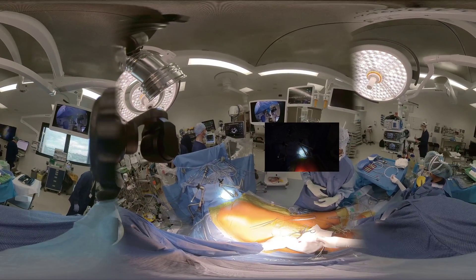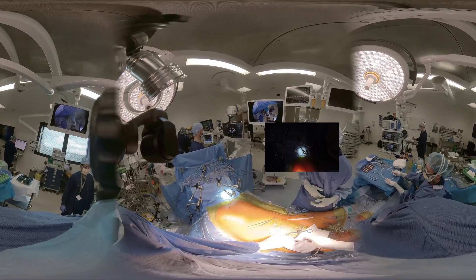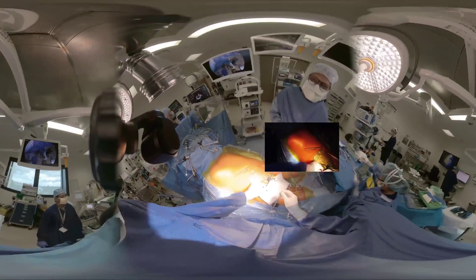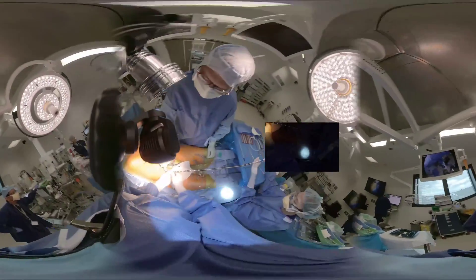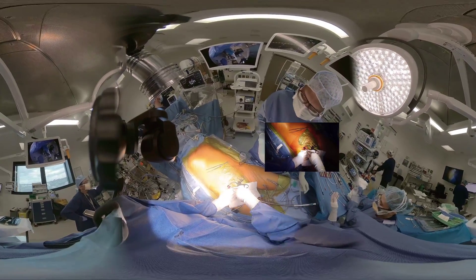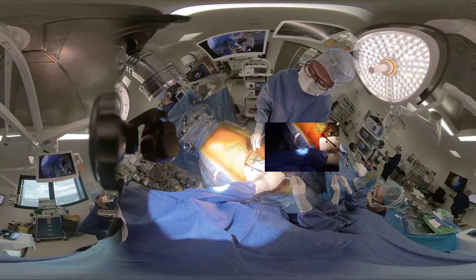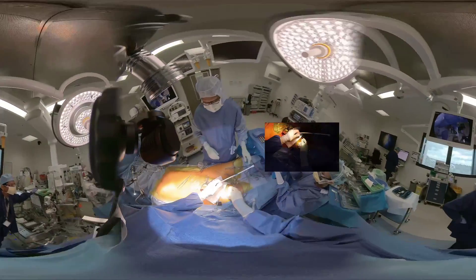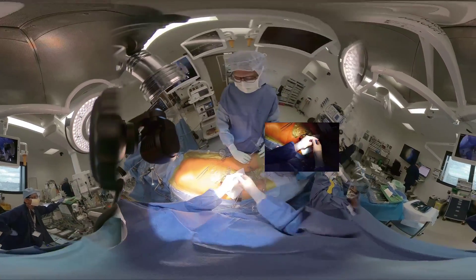Echocardiography is crucial for correct placement and to avoid misadventure with the venous cannula or aortic dissection with the arterial cannula. Good venous drainage is usually obtained with a multi-stage vacuum-assisted femoral venous cannula. We use the Biomedicus Metronix size 21 or 25, with the tip sitting a few centimeters into the superior vena cava.